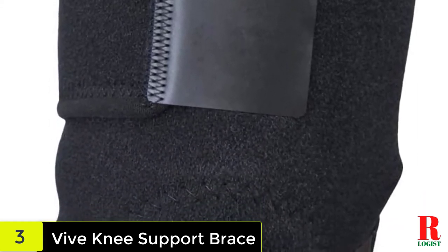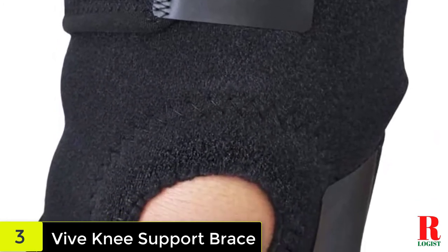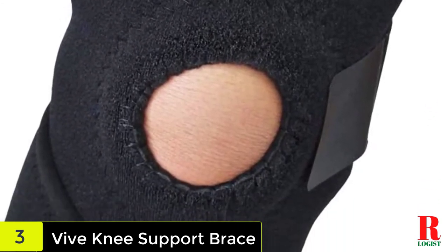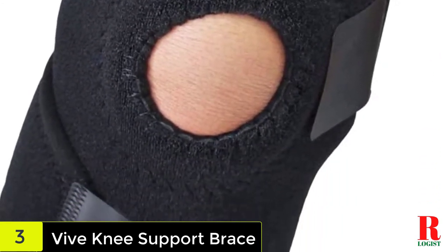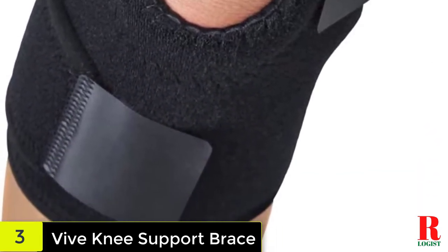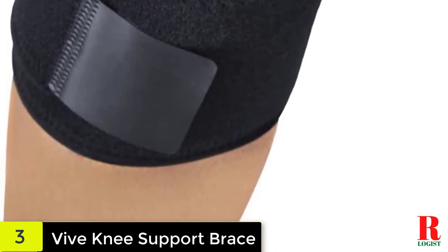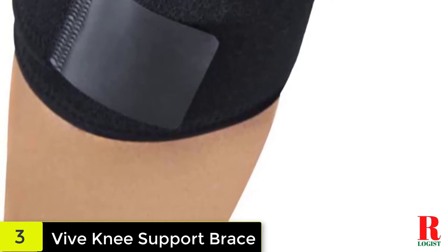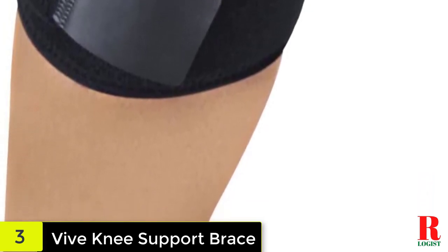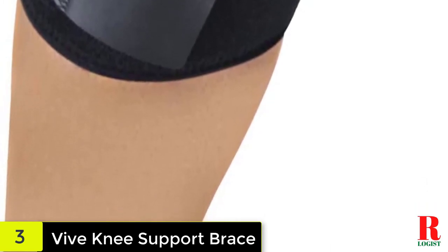Featuring an open patella design, this knee brace can help minimize pressure on the knee brought about by constant movement. It works by supporting the correct alignment of ACL and MCL, which helps to ease the strain on the patellar region. This can help improve the patient's range of motion, allowing them to go on with their day-to-day activities. Featuring three durable fastening straps, this brace can be easily adjusted to accommodate most knee sizes up to a circumference of 17.5 inches — simply loosen or tighten the straps to set the level of compression needed for optimal support.